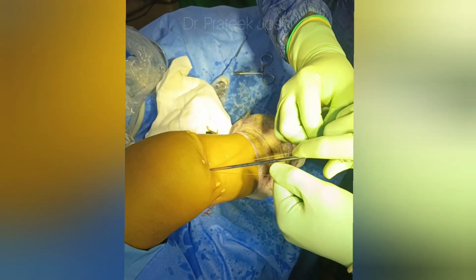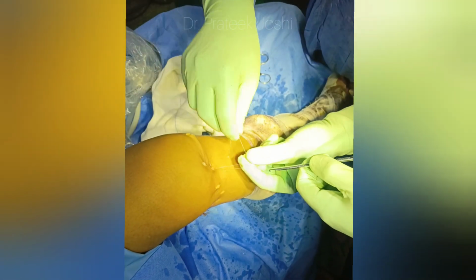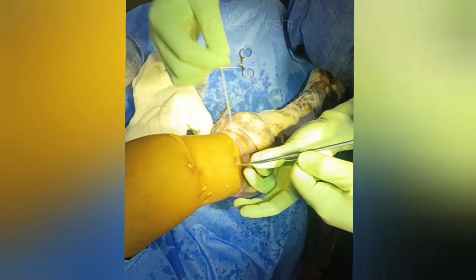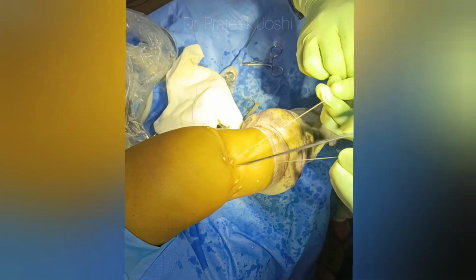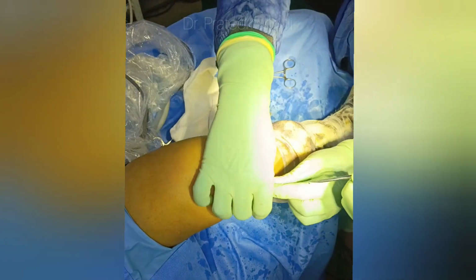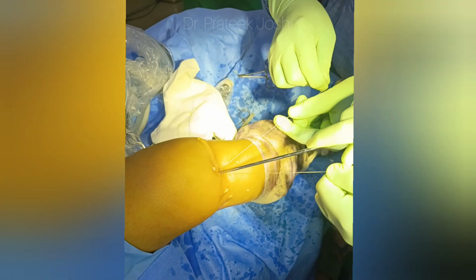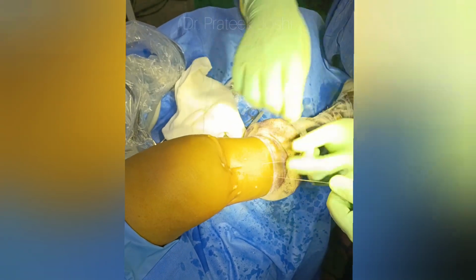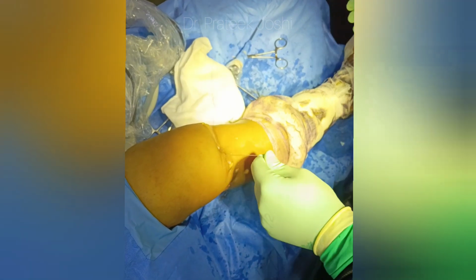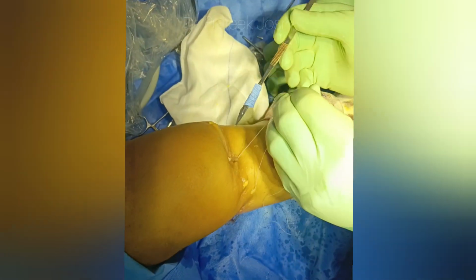Before tying the knots, we usually put incision between the two threads, and then we shuttle the threads through the subcutaneous plane inside the incision, and then we tie the knots as you are seeing in this video. Usually we run 5 to 6 knots and then we cut the threads flush.